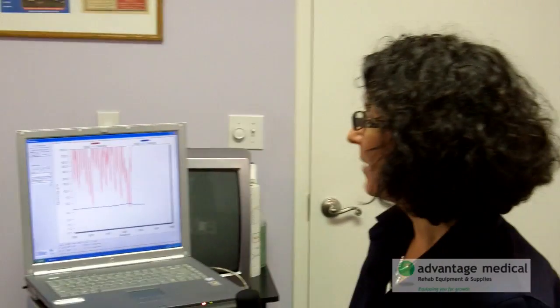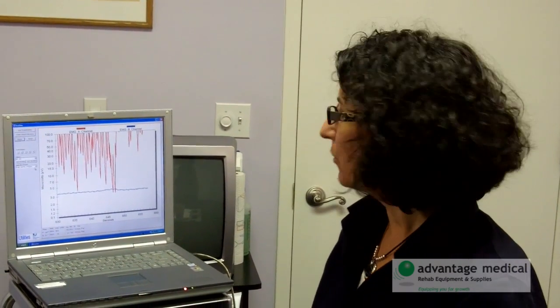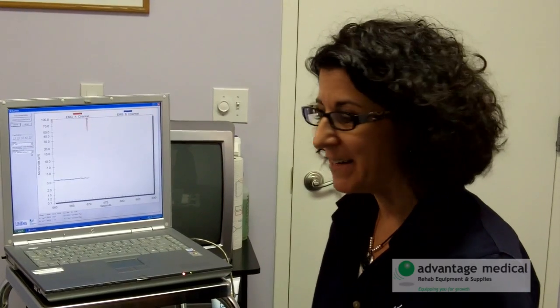Joan, you did great with that. I'm able to see what you're doing on the computer. We're collecting your data and I'll be able to compare it each time, and we'll be able to see that you're able to hold the contraction for longer. So today it's just really learning — you're just figuring out how to use those muscles, and that'll have carryover to what you do at home. It's very important that you do your exercises every day, not just when you come to therapy a couple times a week.